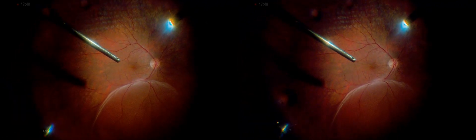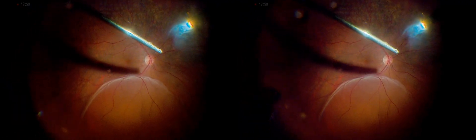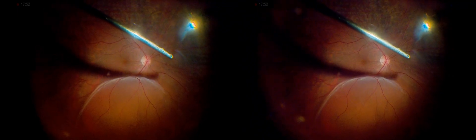A 23-gauge pars plana vitrectomy was performed carefully — a complete one from core to periphery — while avoiding contact with the lens equator. Precise, synchronized movements were employed by tilting the eye and instruments simultaneously.